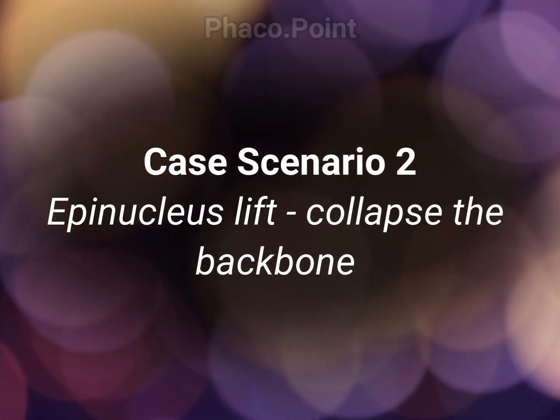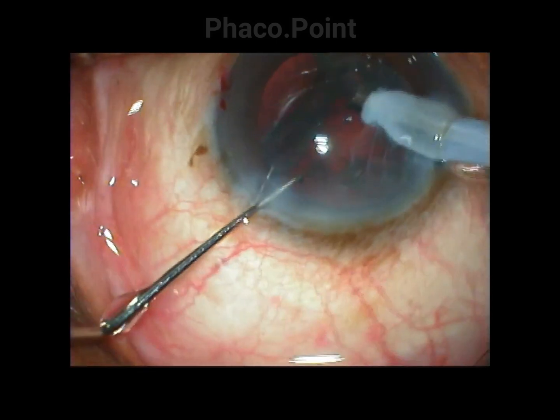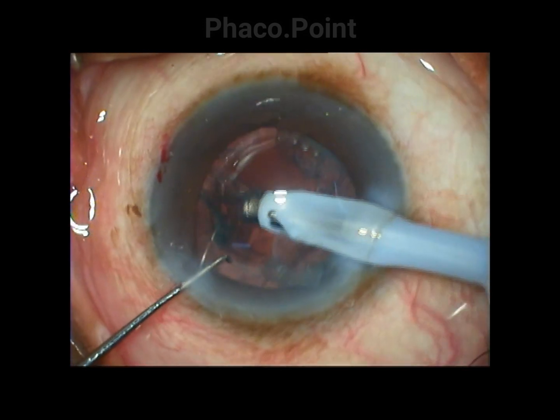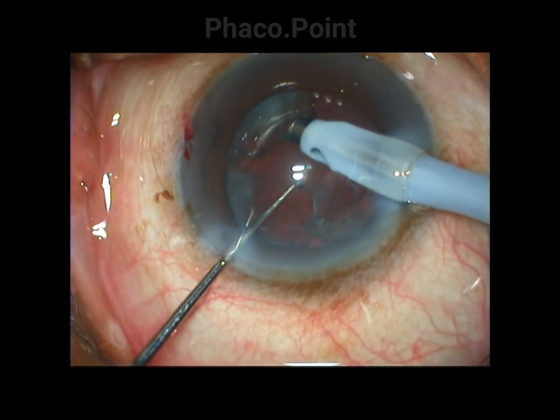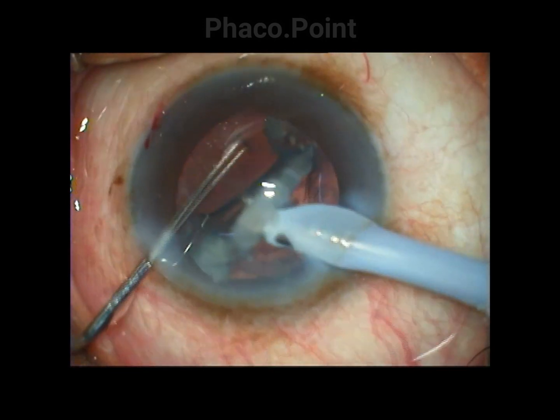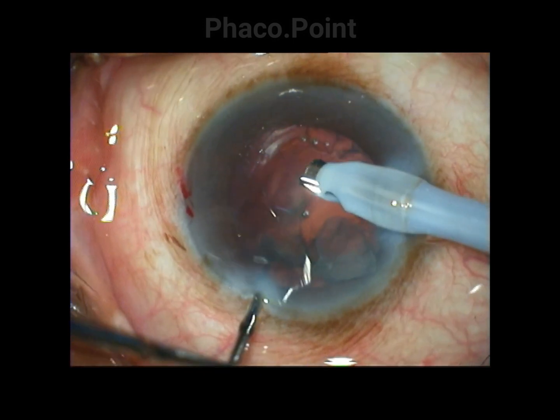An easier way to do this is in case number two, where once I try to get hold of the epinucleus shell and catch hold of one of the fringes, I am actually able to curl the epinucleus shell. However, the hold is not good enough or the plate is not stiff enough to come out of the capsular bag. Hence I pass a Sinski hook underneath it and bend it at its back.